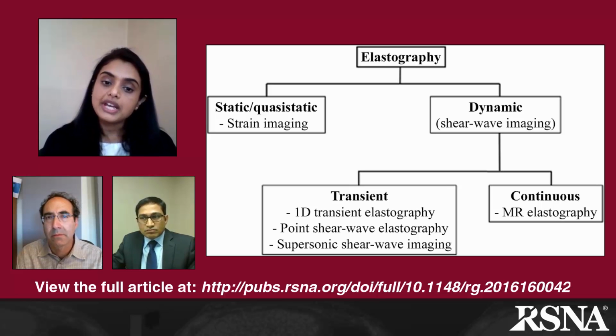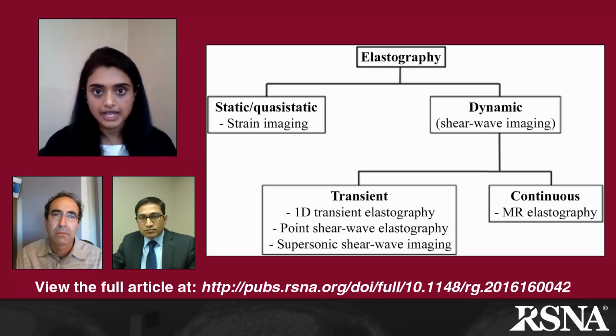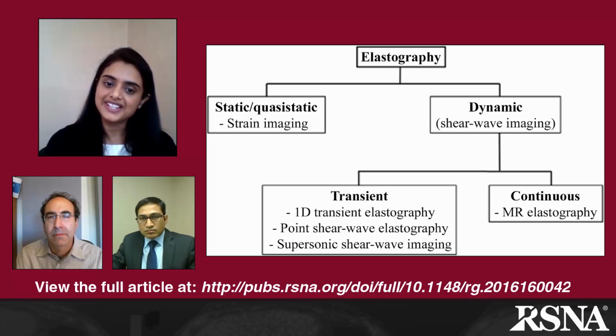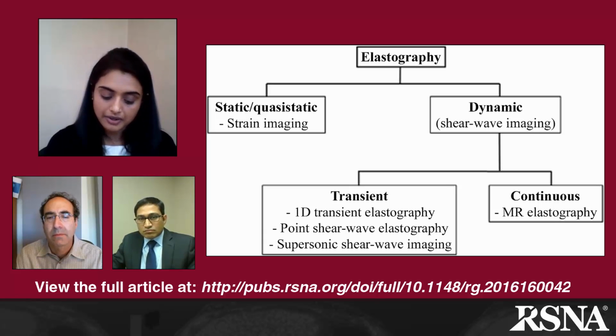There's also use of ARFI, which is acoustic radiation force impulse, for example, in point or supersonic shear wave techniques. So what it does is uses sound waves to produce shear waves, and measurement of these shear waves again helps grade the degree of fibrosis. The supersonic technique uses continuous acoustic radiation force impulses to produce a cone of shear waves, and it's a much more sophisticated technique. More of the liver tissue can be assessed, but it is still in nascent stages, so it's still in infancy, not widely available in the market.